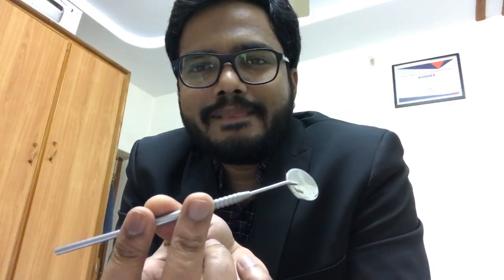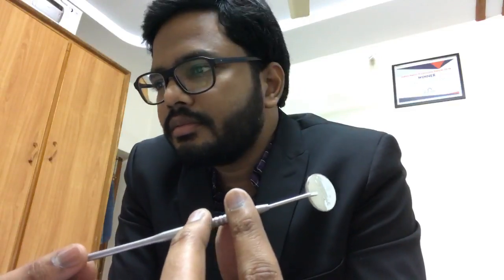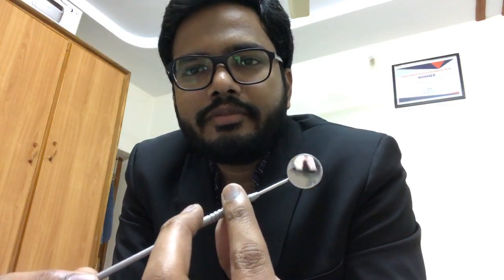Yeah. And finally, tell me the other name for mouth mirror. Other name for mouth mirror. Can you see another image in the mirror? I think you can play for some time. So my image is getting reflected here. It's also called as odontoscope. It's also called as cone and socket instrument, odontoscope. Okay. So, reflection, retraction, and illumination, right?